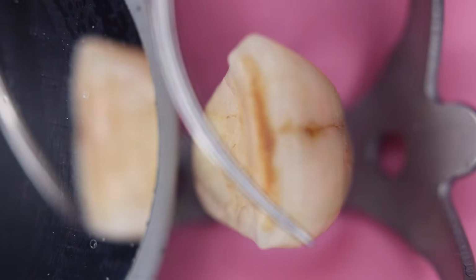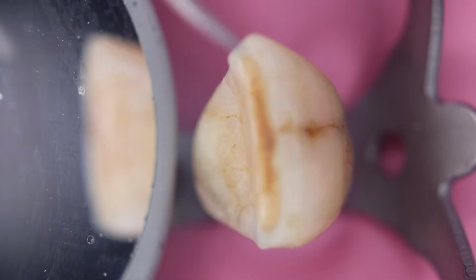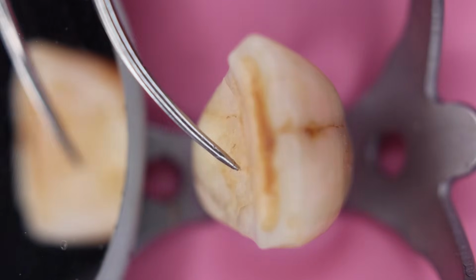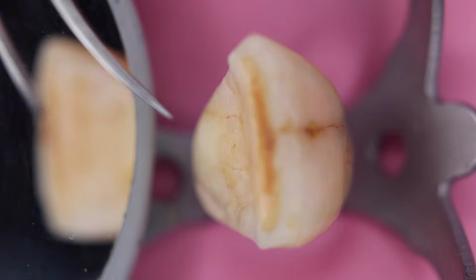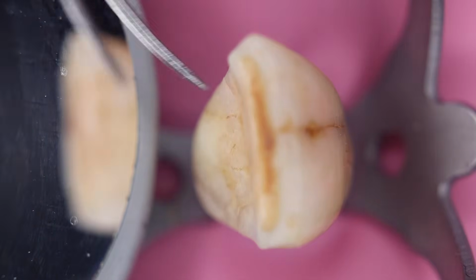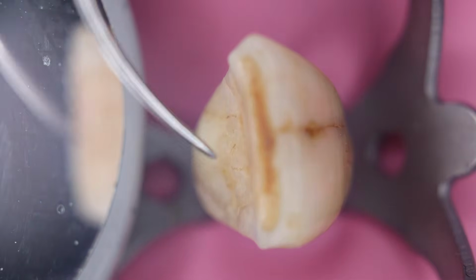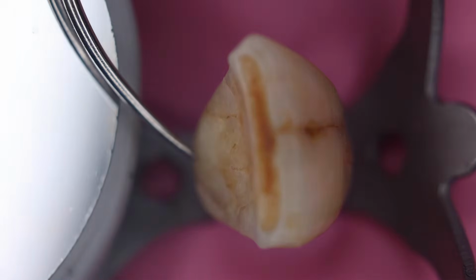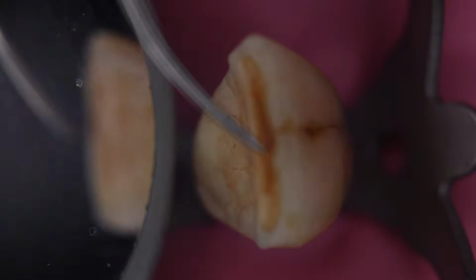If there are adjacent teeth missing, you can appreciate it with the help of the incisal angles. Now, where to approach? From the distal side, the mesial aspect, or the cingulum aspect? What are the conditions that we can fulfill to prepare the access cavity, considering this tooth?